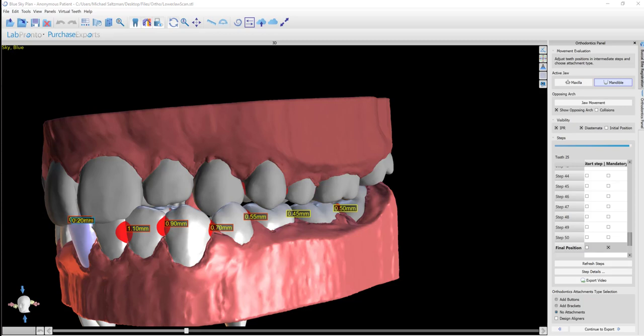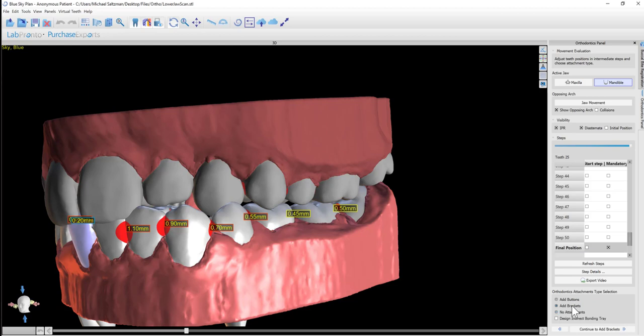After the virtual tooth setup is complete, we have the option of continuing to add brackets. In the bottom right of the panel, you can select the option to add brackets.